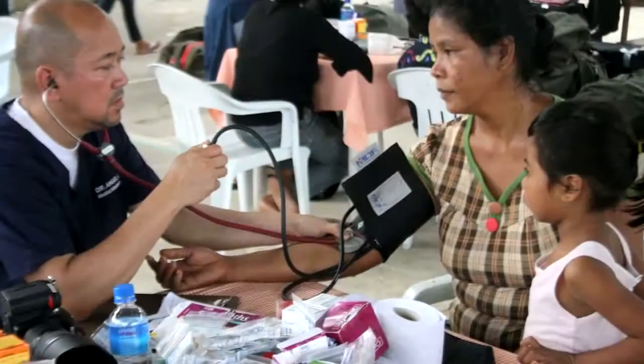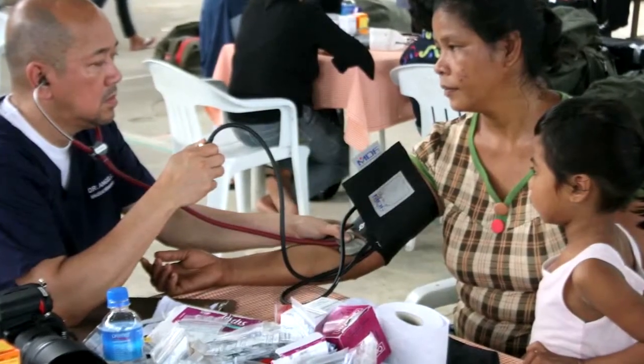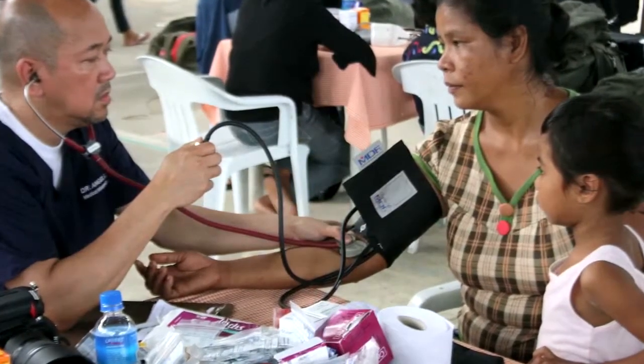So for us it just wasn't right. This is a device that's supposed to measure a patient's blood pressure, a key indicator of health, over and over again. So that means that the device needs to last and it needs to be accurate.